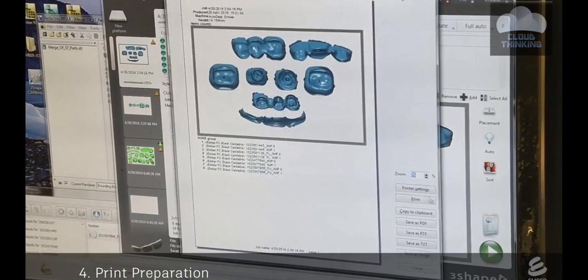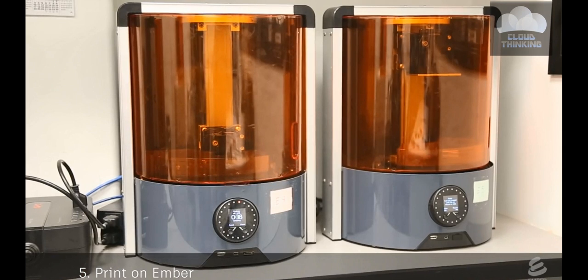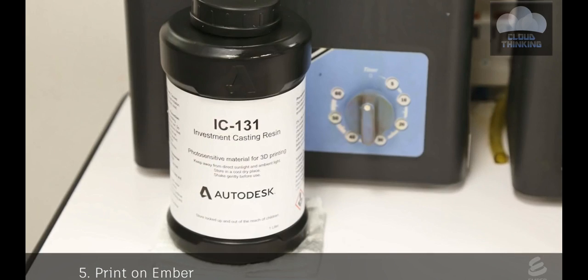Now this collection of crowns is sent to an Ember printer. A tech starts the printer. The print time is typically around 40 minutes. Glidewell uses a specially formulated resin, which will completely burn out later in the process.